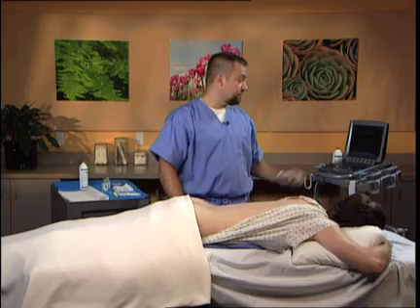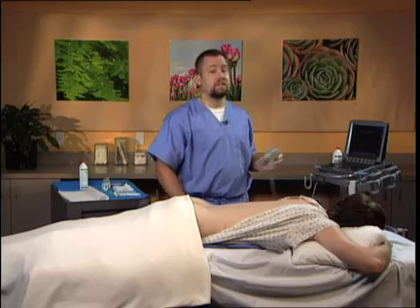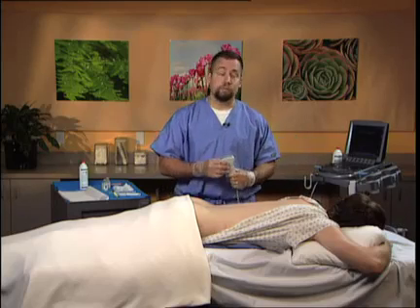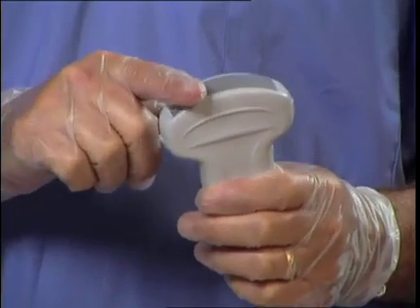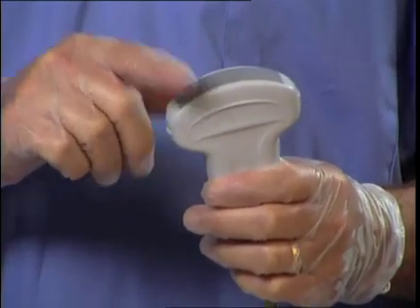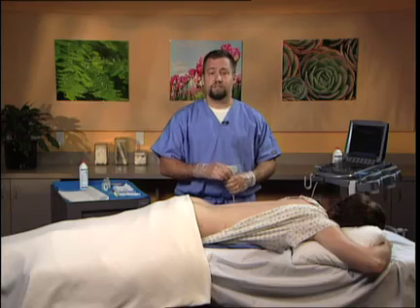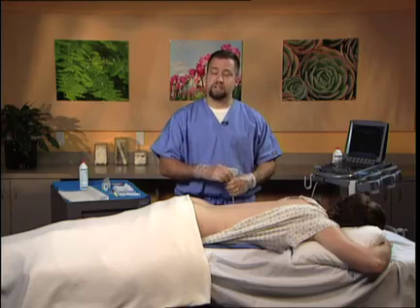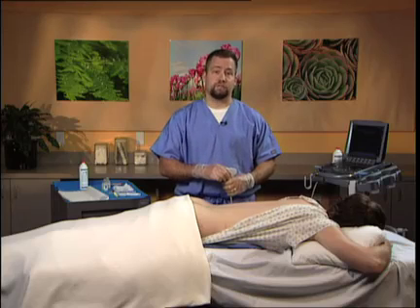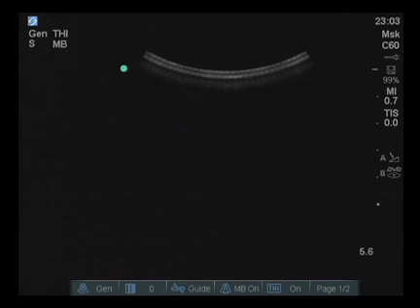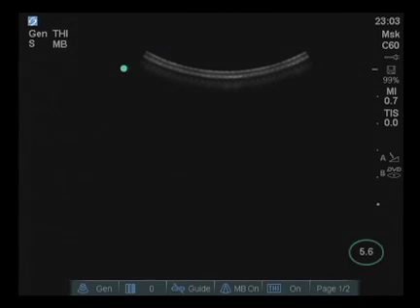In this particular case, I'm going to be using a Sonocyte C60 probe because of its curvilinear shape, which will facilitate viewing of the sacral anatomy. This is key for the demonstration of the relevant anatomy and ultimate placement of the needle for successful completion of the procedure. The settings are set for 5.6 cm depth — obviously this is patient-specific, as a larger patient may require a deeper depth.